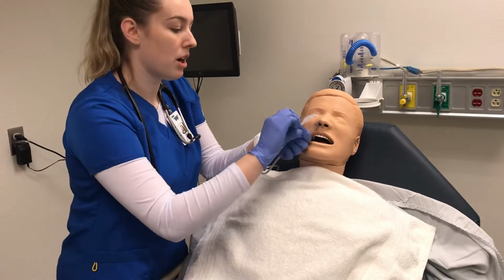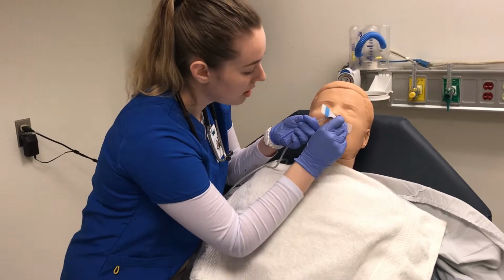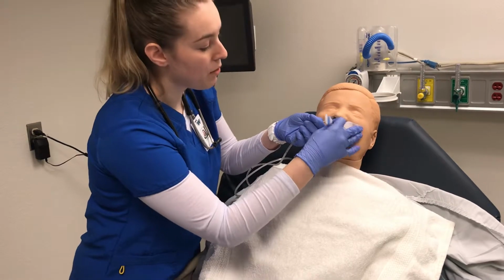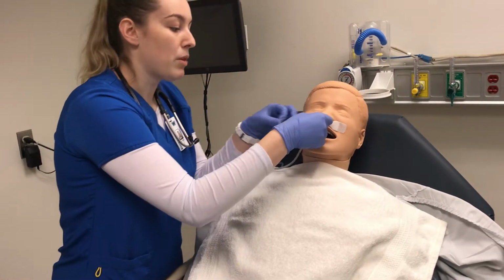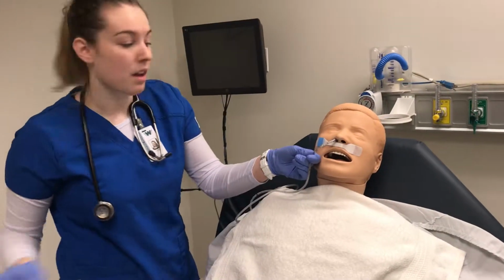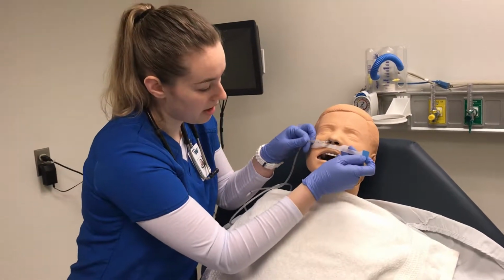So I can put the strip on Shirley. So I know we had other strips for the video, but because I am re-recording today, I am going to use this one. Are you okay, Shirley? Thumbs up? Okay, good.